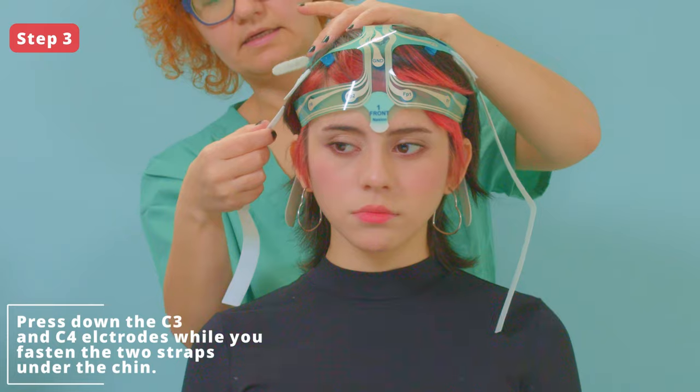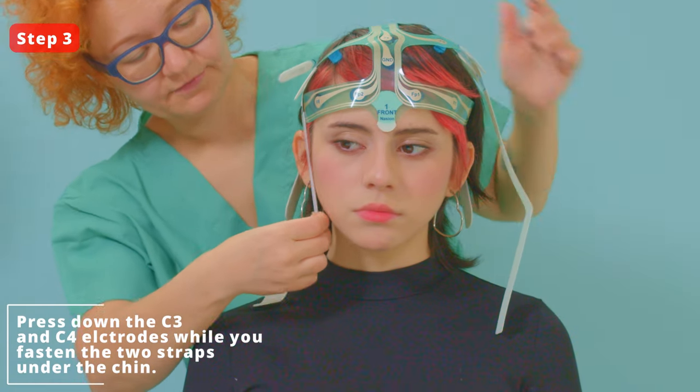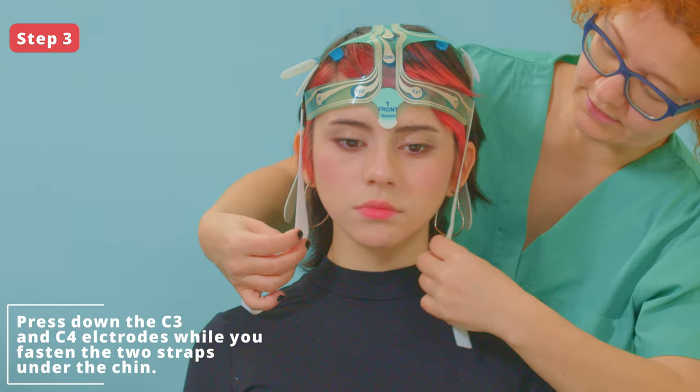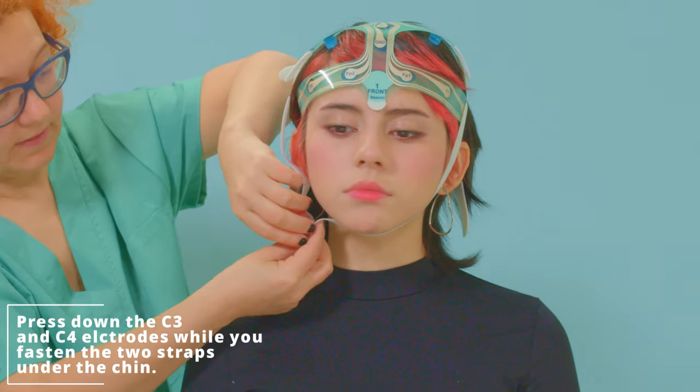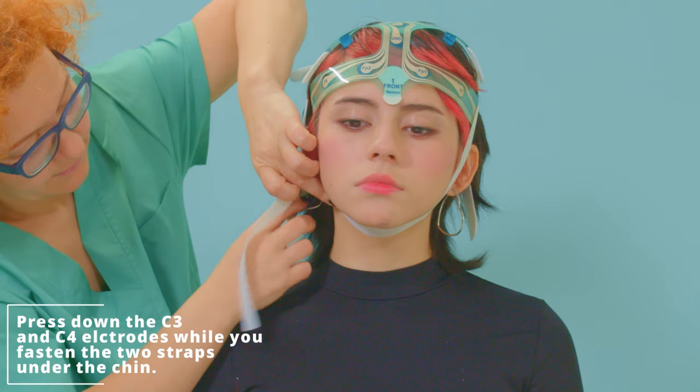Step 3. Place and press down the C3 and C4 electrodes, separating the hair. Fasten under the chin. Do not over-tighten under the chin so as not to cause the patient discomfort.